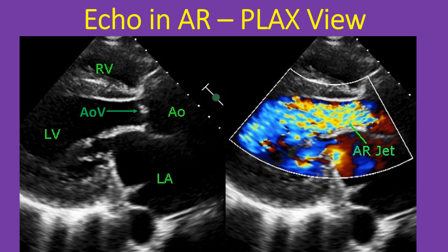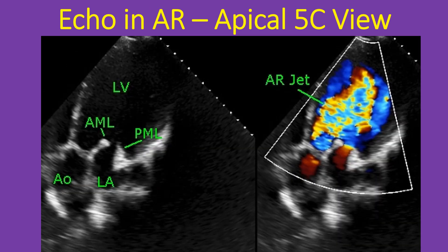Dilated left ventricle, aorta, and left atrium also suggest that the AR is severe. An apical 5-chamber view shows the dilated left ventricle, thickened anterior mitral leaflet, and posterior mitral leaflet. In this view also, the AR jet is large, extending deep into the LV, indicating severe AR.